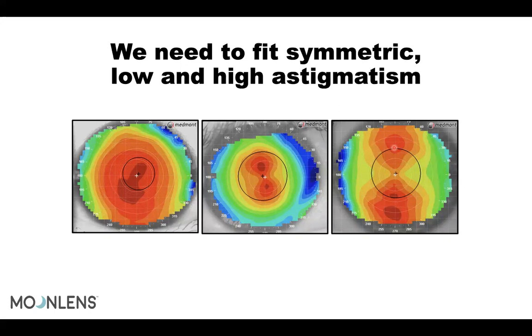But that's the good thing about the calculator, because the calculator is going to tell you already if you need a symmetric lens or a toric lens. Like I was telling you, that's the beauty of it, just knowing with that what type of lens you are requesting. So this will help. And immediately after seeing this, you're going to know it's going to be a toric lens, sorry.